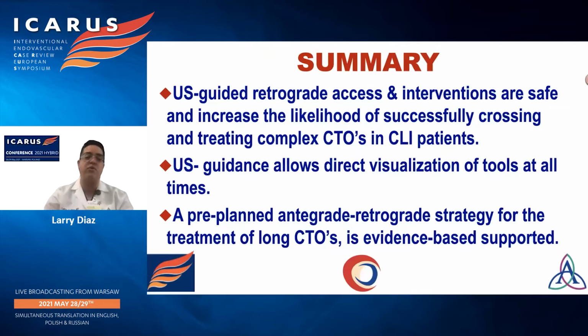So in summary, ultrasound-guided retrograde access and interventions allow us to safely and effectively treat these CTOs and CLI patients, given that it allows us to directly visualize all the devices that we're using, from guide catheters to wires and atherectomy devices, et cetera. A pre-planned antegrade and retrograde strategy for the treatment of long CTOs is actually based on science that has already been published.